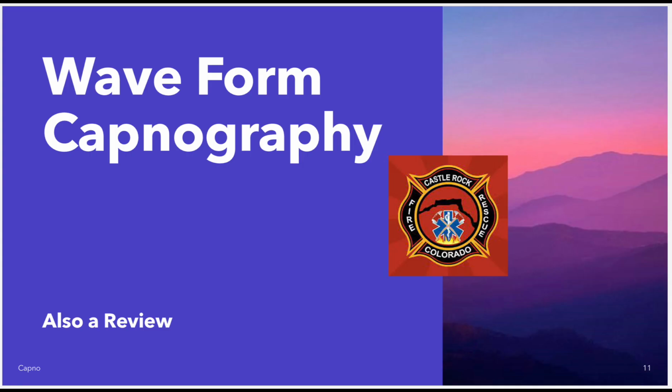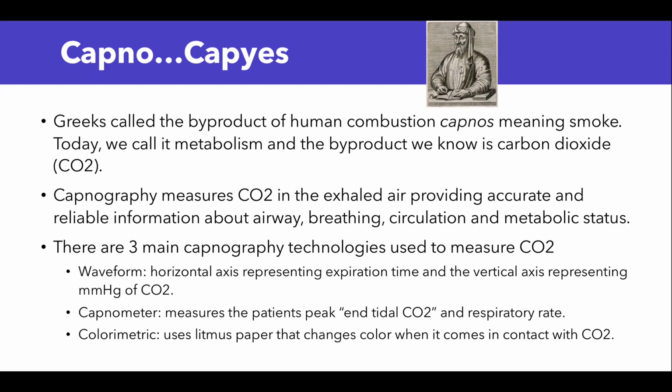Now we're going to review waveform capnography. A little fun fact, the Greeks called the byproduct of human combustion capnos, meaning smoke. Today we call it metabolism, and the byproduct we know is carbon dioxide. Capnography measures CO2 in the exhaled air, providing accurate and reliable information about airway, breathing, circulation, and metabolic status.